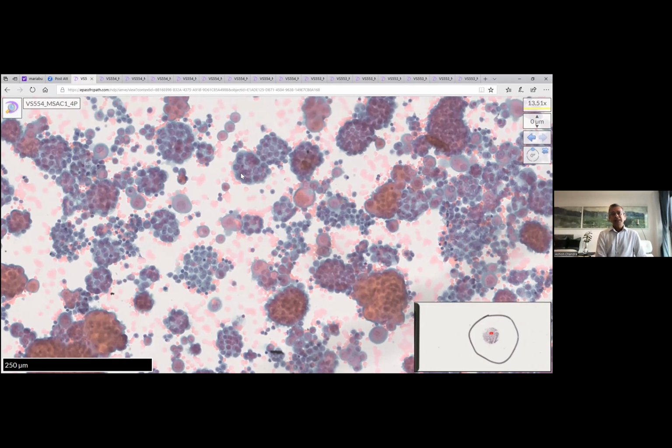three-dimensional clusters. And then the next step would be to say this is a mesothelial proliferation, and depending on the history this may represent mesothelioma. Then you would do a panel, which includes BAP1, desmin, epithelial membrane antigen, and even P16 or MTAP deletion by FISH, for confirmation. And again, that is to demonstrate your knowledge. It doesn't mean that your lab is doing it on a daily basis, or whether you have or haven't got access to it, but in terms of demonstrating your knowledge for getting that extra point, that's what we would expect.